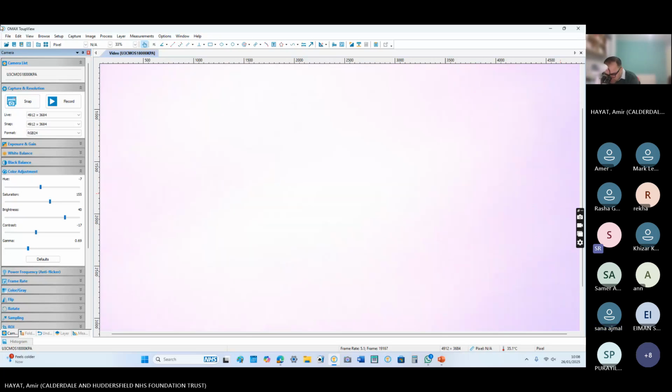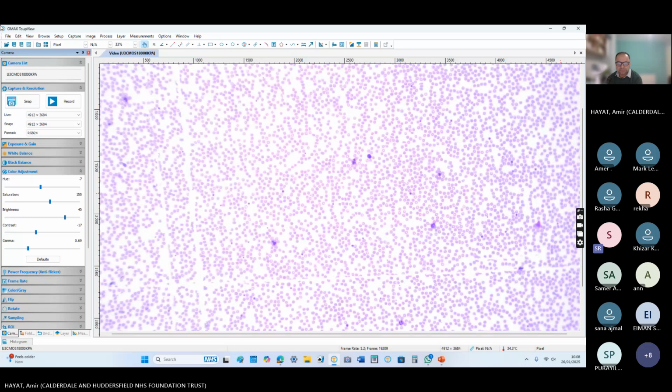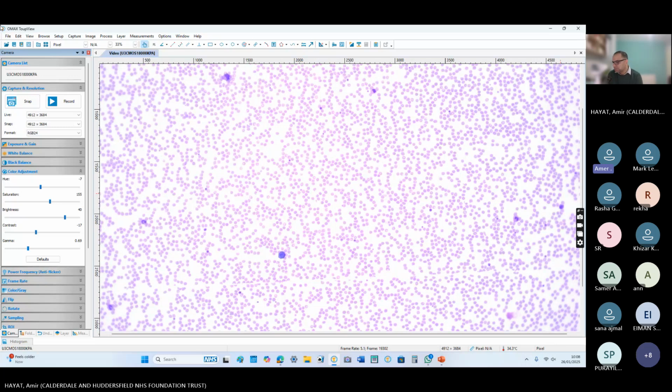It is also written that in the treatment we have to give strongyloides cover, whatever the underlying cause. So is that true that we have to give it in every case? I heard that it is only for ATLL patients, but not for strongyloides in eosinophilia. If strongyloides infestation is not the cause of eosinophilia, why should I give the treatment for that? Because we have many eosinophilia patients in our clinics, but they are not using any worm-related treatment.